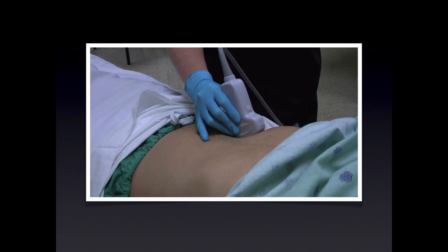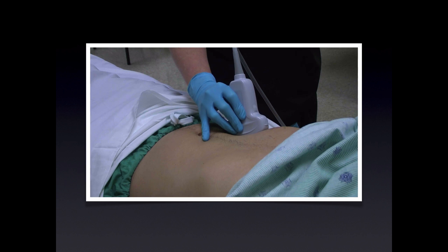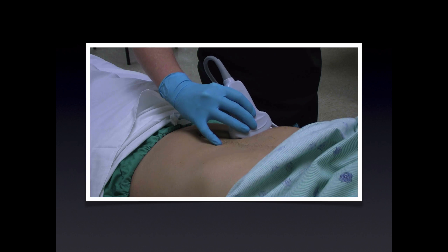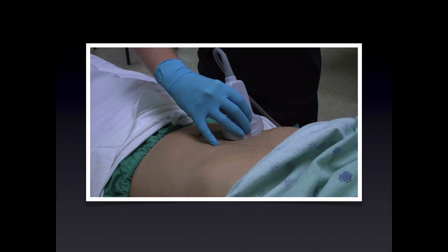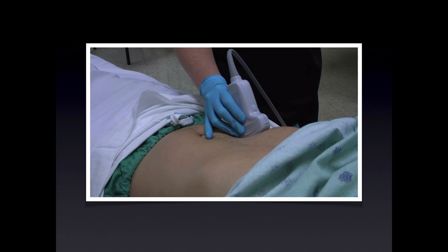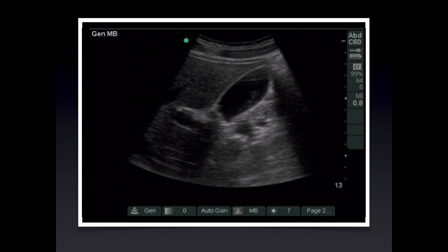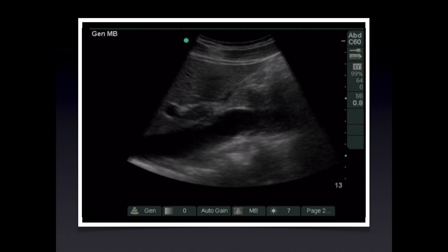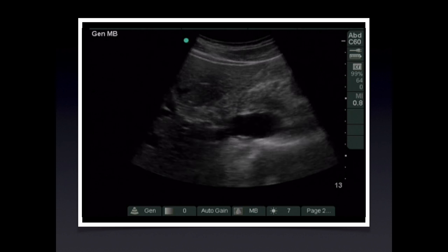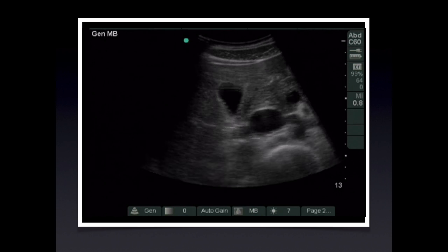Here's how to do just that. Sweep through the gallbladder from side to side, either by fanning or moving the transducer on the skin. Then ideally keep the gallbladder in view while switching planes and sweep all the way from bottom to top. Like any organ sweep, it's only complete if the organ goes completely out of view at the margins of your scan. Here's the corresponding ultrasound clip: first our sagittal sweep all the way from side to side, the gallbladder going completely in and out of view, switching planes, and now scanning all the way from top to bottom and bottom to top.